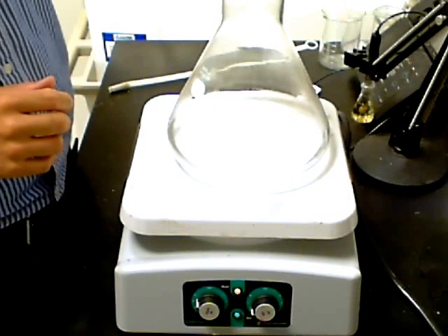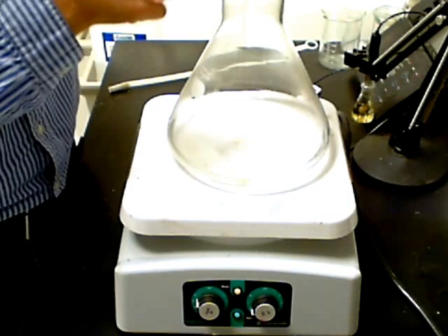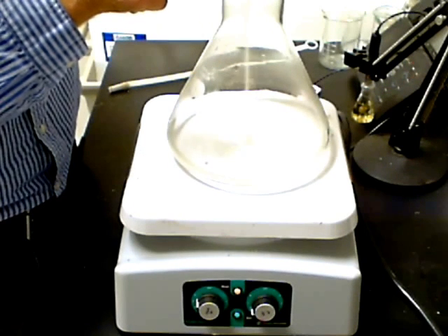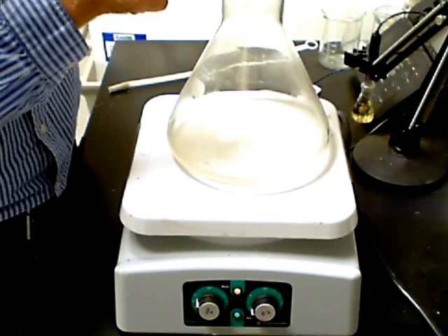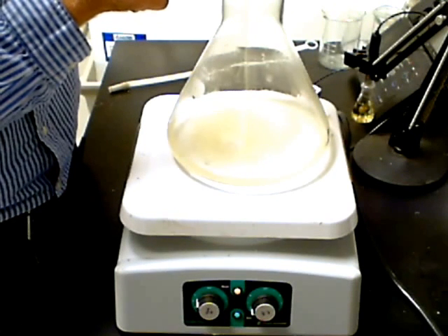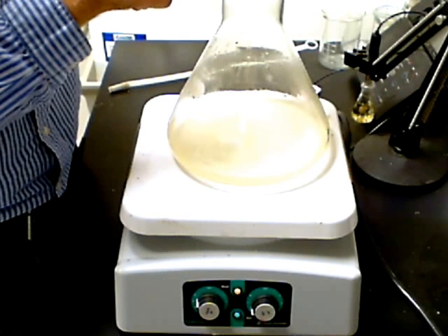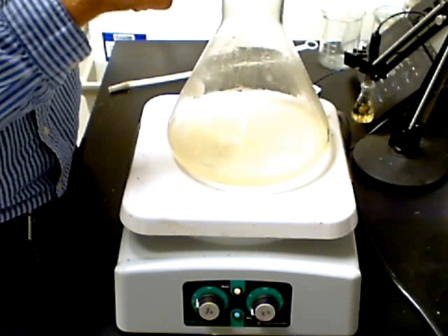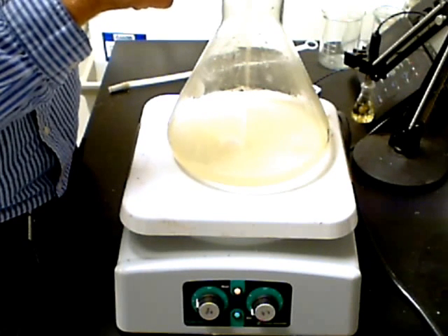Add the powder to the flask a little bit at a time. Adding the entire 11.5 grams of powder all at one time will result in the powder forming clumps. This process may take a minute or two, so be patient. As you add the powder, you can see the water changing from clear to a cloudy, pale yellow. Notice the steady stream of powder being carefully added to the water.